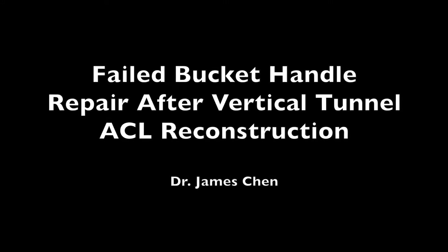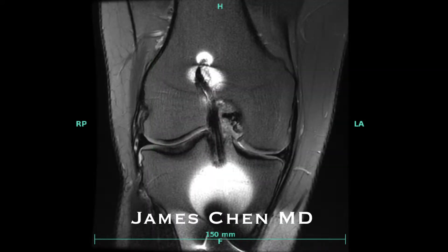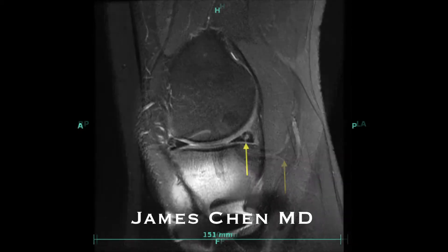This is a video of a previously failed bucket handle repair due to a vertical tunnel and graft placement. Here is an x-ray of a patient who had his reconstruction done by another surgeon who put in a graft straight up and down vertically, allowing the knee to rotate.